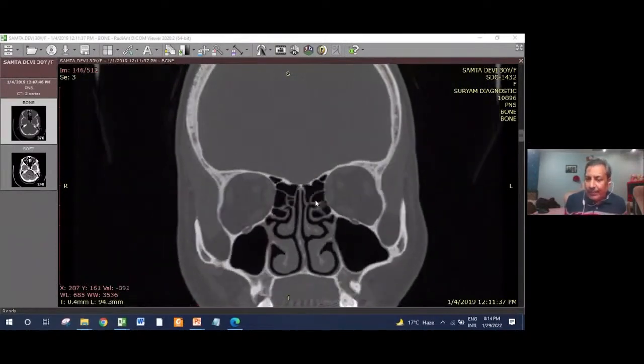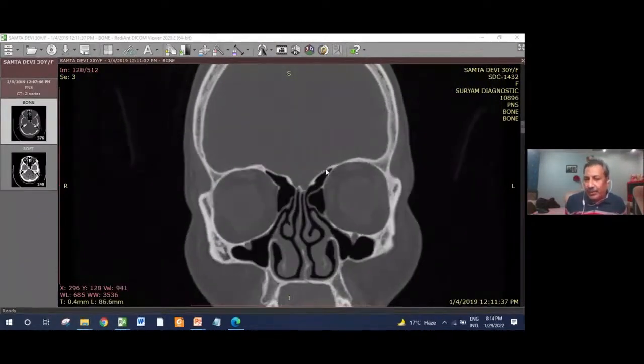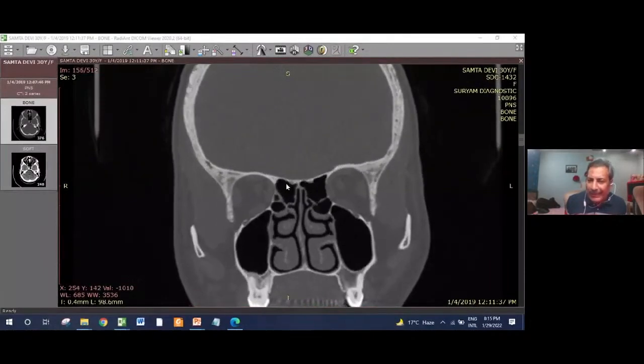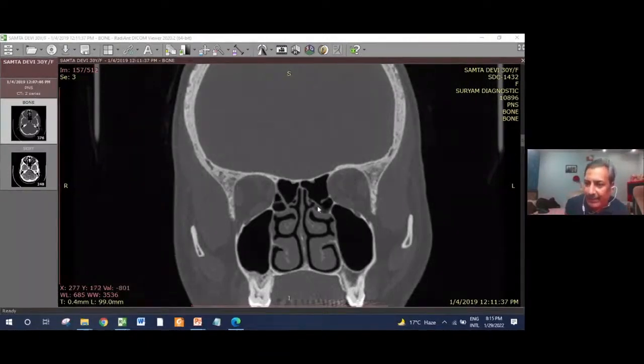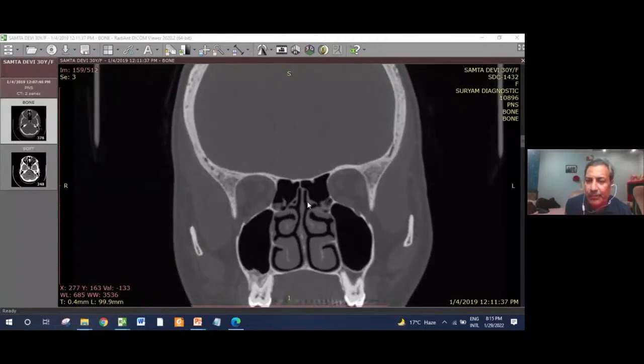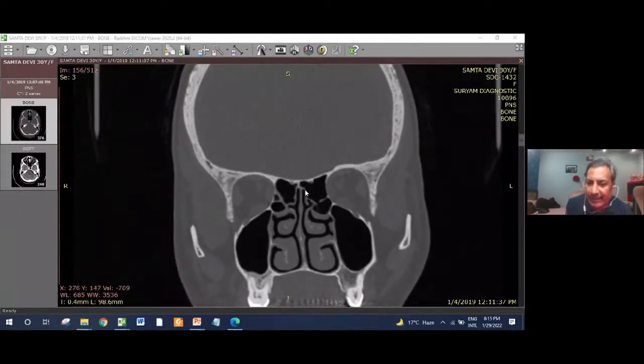And fourthly, the roof of the skull base is changing. This is the anterior ethmoidal roof, so thin. And now as you go behind, the roof of the ethmoid is becoming more and more flatter and much thicker as compared to the anterior ethmoidal roof, where we are always scared when dealing with it. Now, as we go behind, this is the posterior ethmoidal roof, and the turbinates which are attached onto the posterior ethmoidal roof. See the turbinates again. These are superior turbinates.